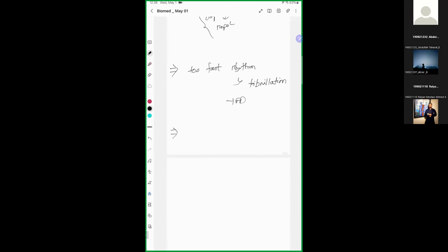Now, let's see one thing. When you are measuring signals like the ECG, there are some issues. What can be the issue? During the measurement, did you stop your breathing? Of course not. When you're measuring these signals from the electrodes, other functionalities of the body are also there.